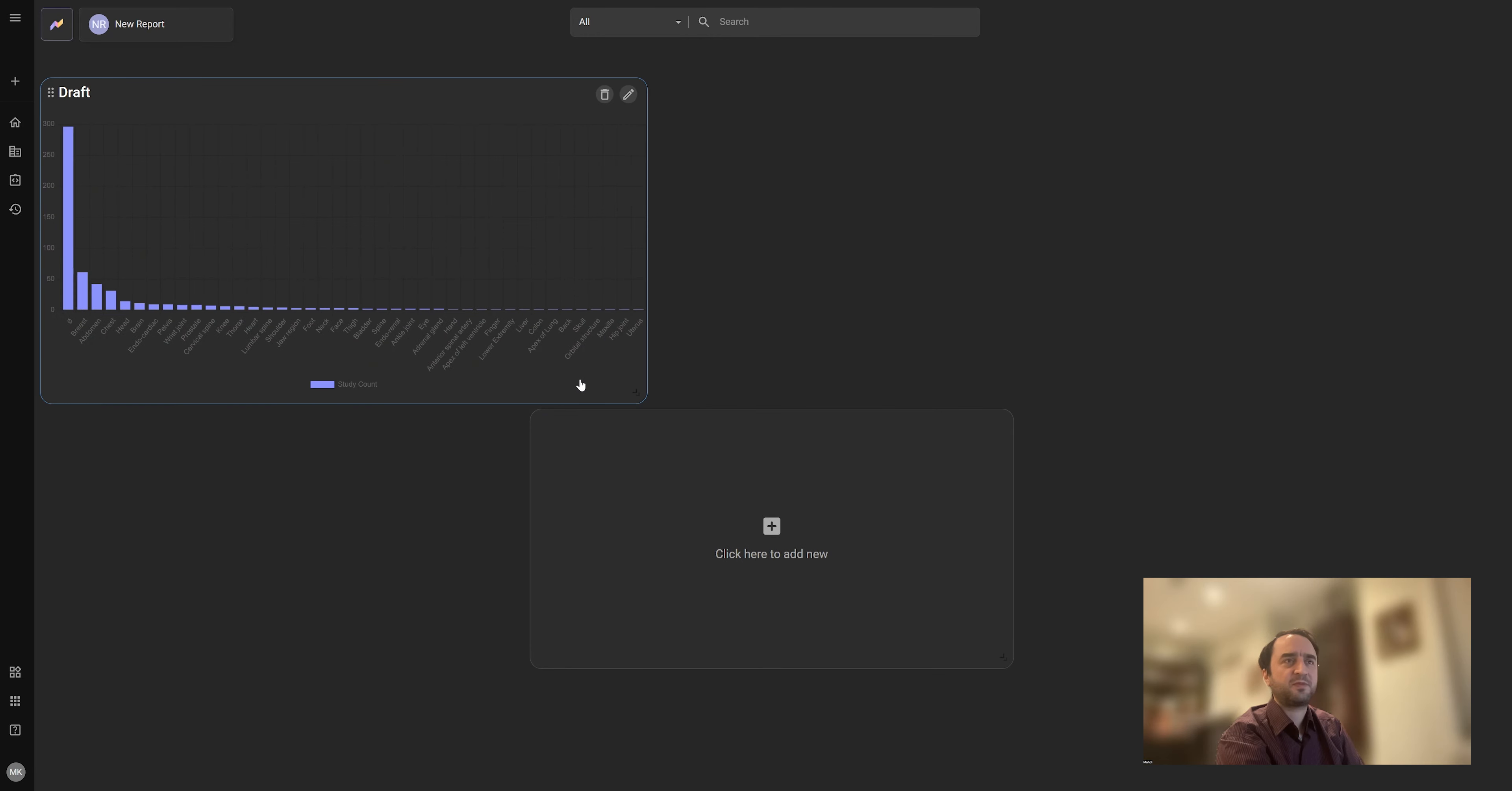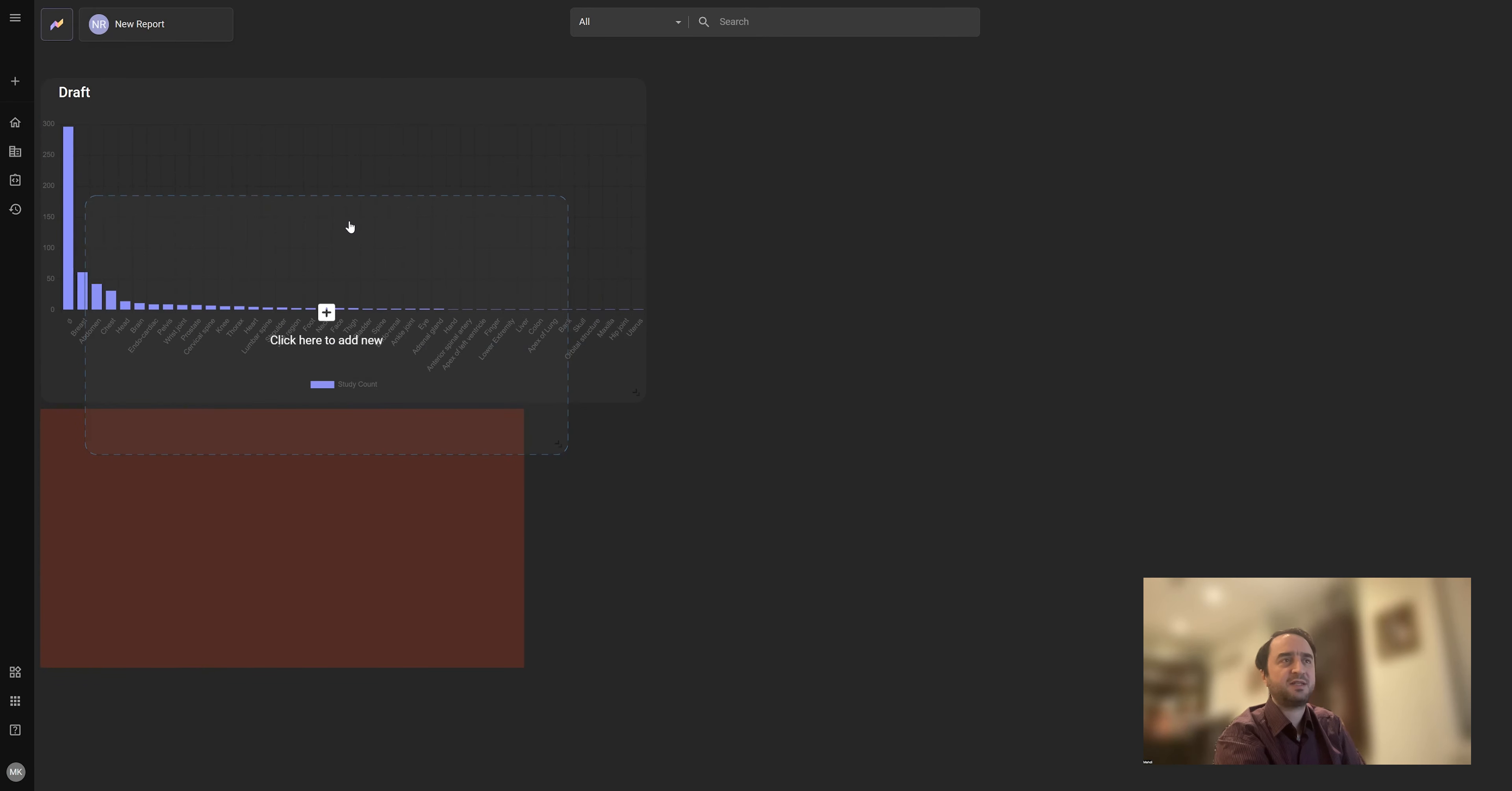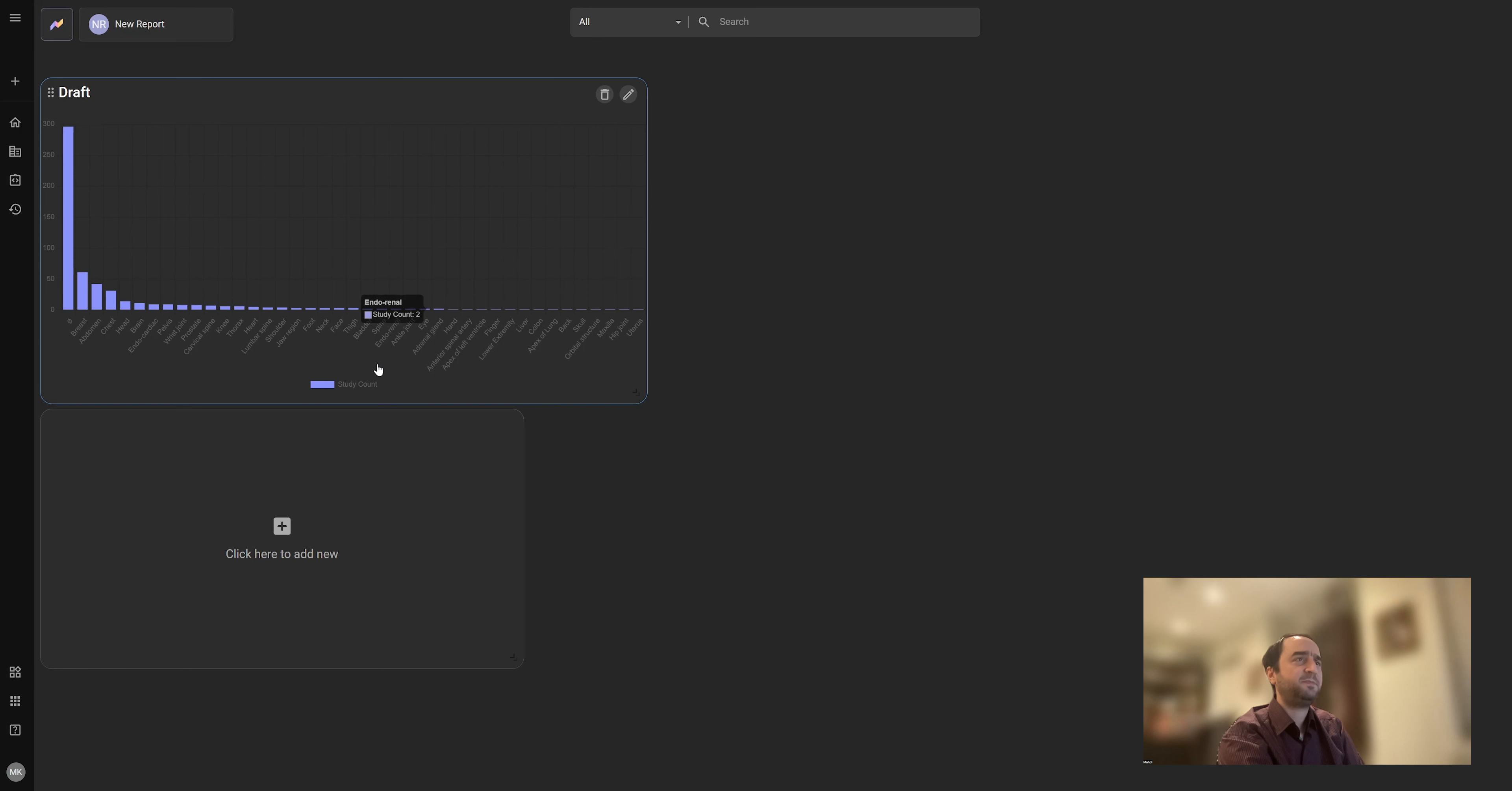Then you can set up your dashboard or report as easily as moving these strings around and adding more items. Like I can easily add a new table now based on patients or other criteria that I want.